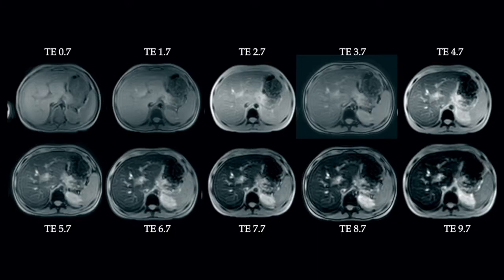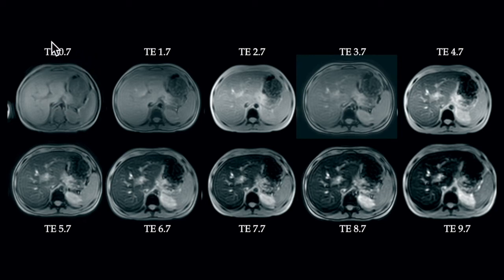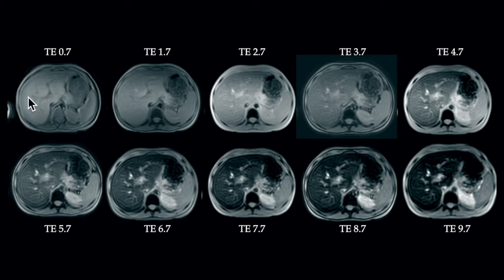This is what the T2 star MRI sequence looks like for the liver. You can see 10 echoes applied in the liver slice. The first TE is 0.7, the TE interval is around 1, and it has gradually increased to 9.7. If you carefully assess these images, you can see the intensity of the liver parenchyma decreases as the TE increases.